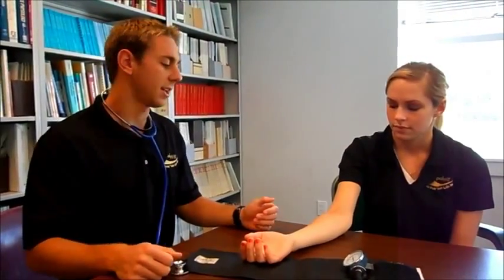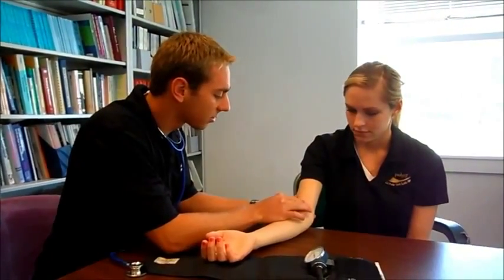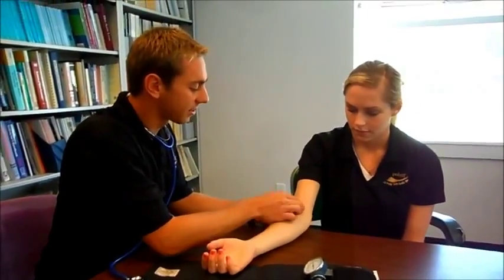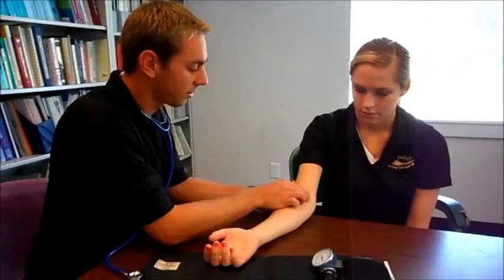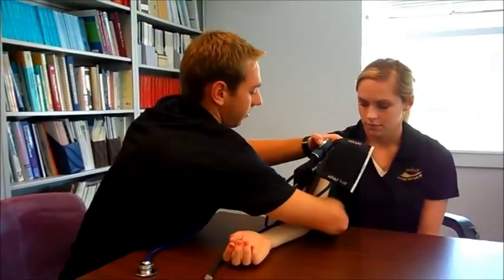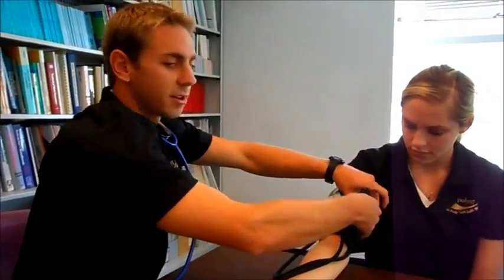Have the patient put their right arm up on the table — we use the right arm for consistency throughout all the tests. Try to find a pulse on the brachial artery, which is usually towards the inside of the elbow. Take a mental note of that location, then wrap the cuff around their arm — keep it snug but not super tight, just so it's not loose and wobbling around.